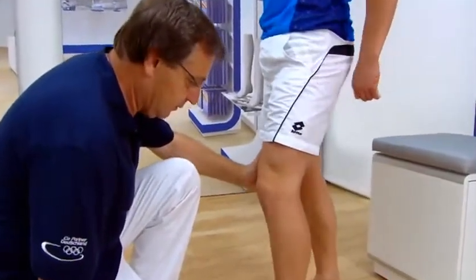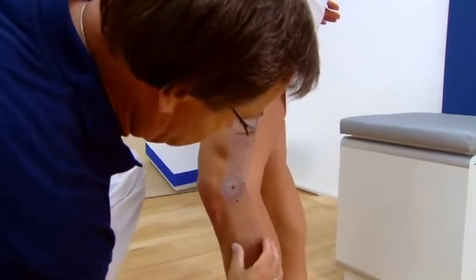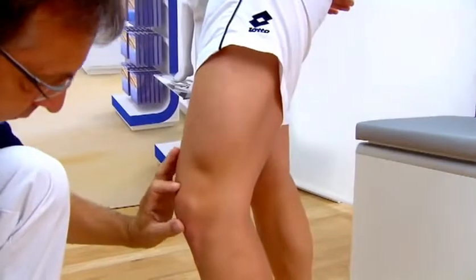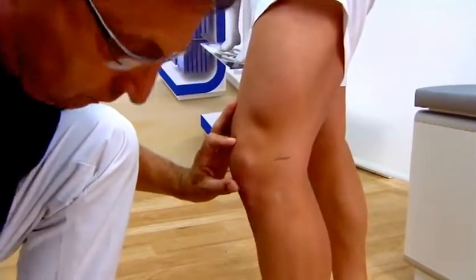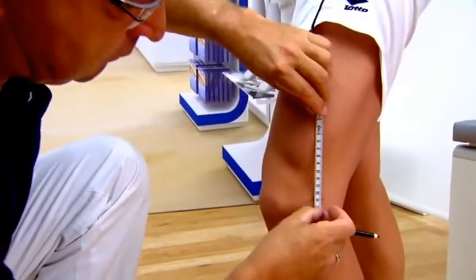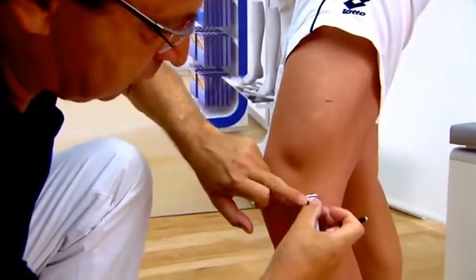For the measurements, the patient bends the knee at a 30-degree angle. The correct angle of flexion is checked using the knee goniometer. The kneecap is then palpated with the thumb and index finger. Mark the middle of the space between the thumb and index finger with a pen. From this point, use a tape measure to measure 14 cm upward and 12 cm downward.